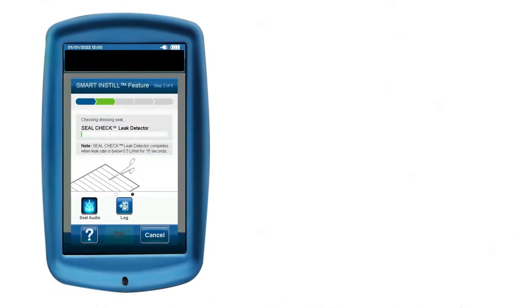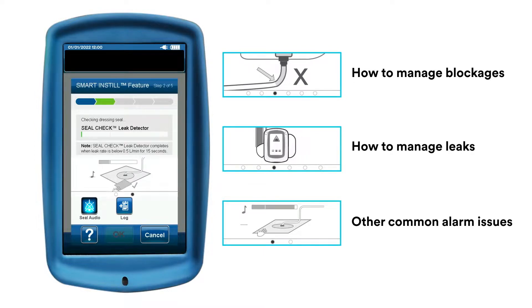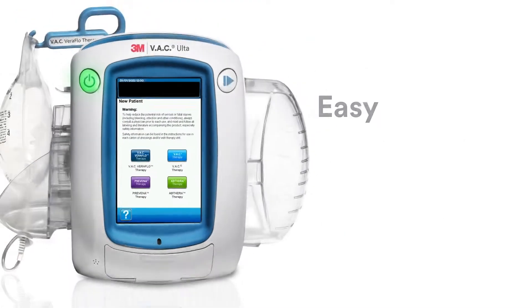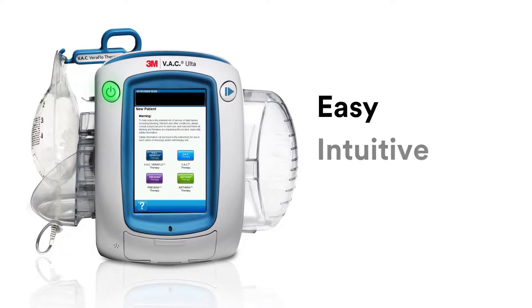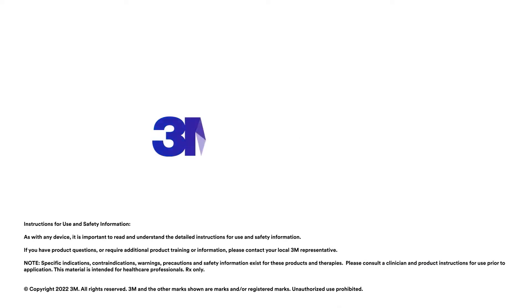Easy to follow animations on the device provide guidance on how to resolve common causes of device alarms. Easy to set up. Intuitive interface. Smart design. 3M VeriFlow Therapy with the Smart Instill feature.